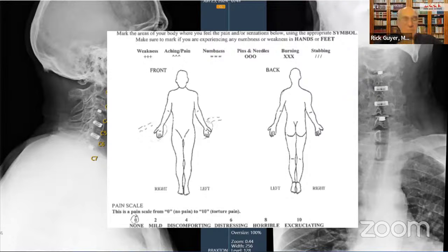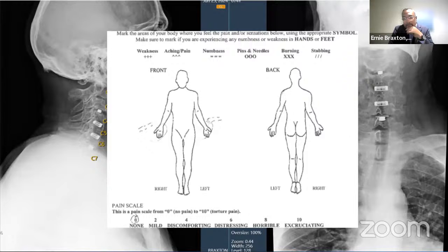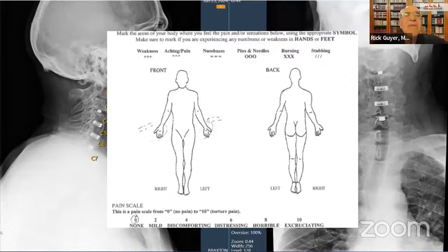Ernie, let me ask a question. Yes, sir. Did you give him any prophylaxis for heterotopic ossification? He did have a bone spur at that 3-4 level. So, well, the index operation. Oh yeah. So the index operation, obviously, no. And then I didn't mean for that. I meant for the arthroplasty.